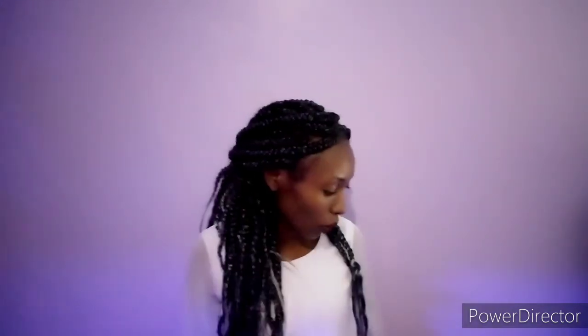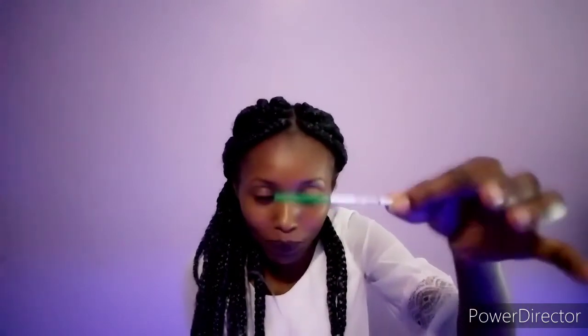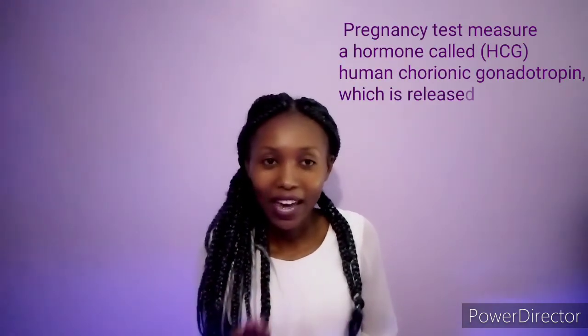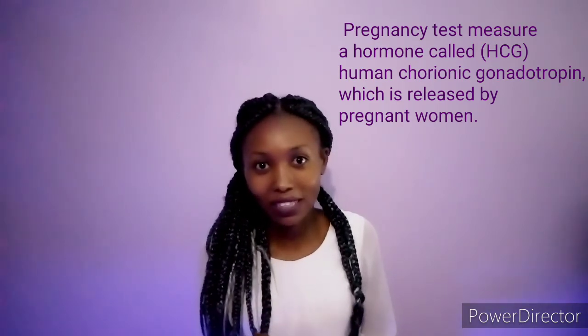Okay, inside it, I've opened it already. It's not a big thing, it's just a small thing right here. I hope you can see it clearly. So I'll just discuss this in a simple way. As you can see, this strip right here has been made in such a way that it has a hormone which can analyze your urine and tell you whether you're pregnant or not.